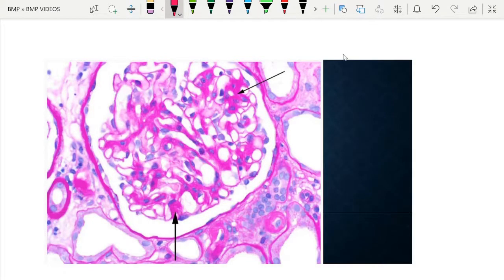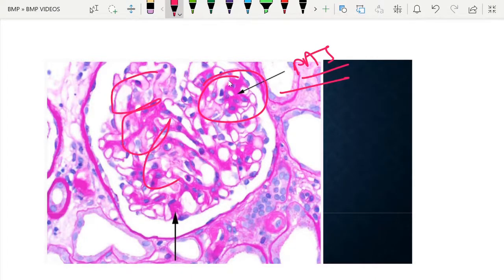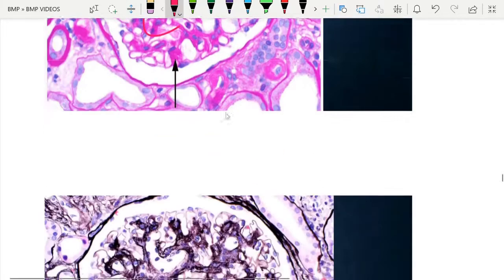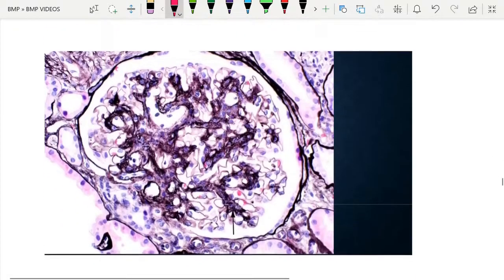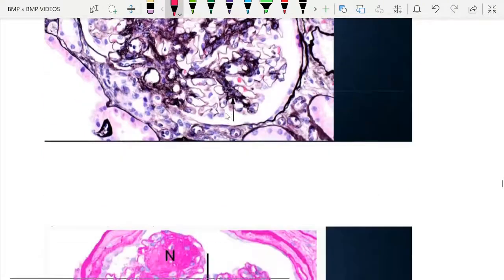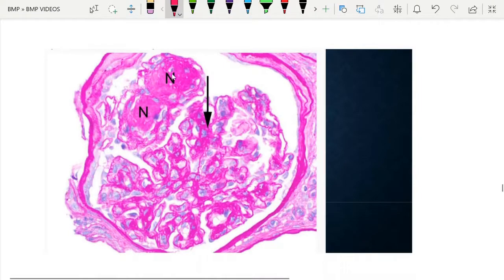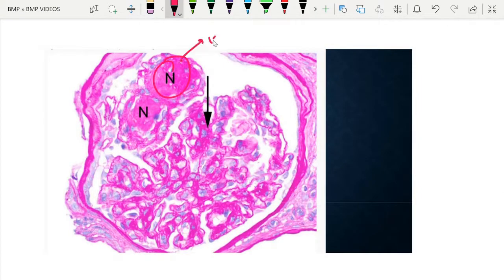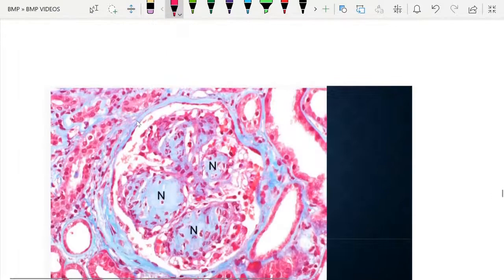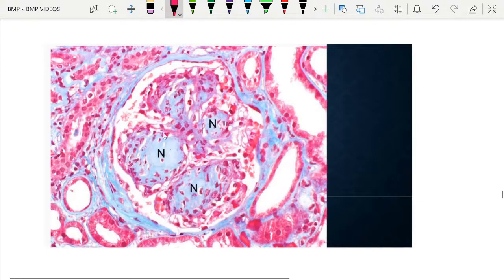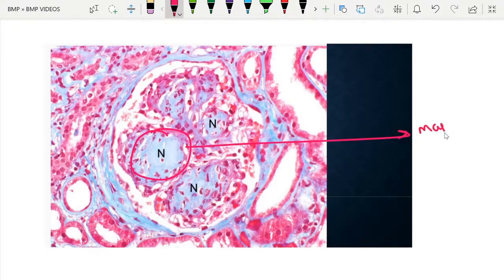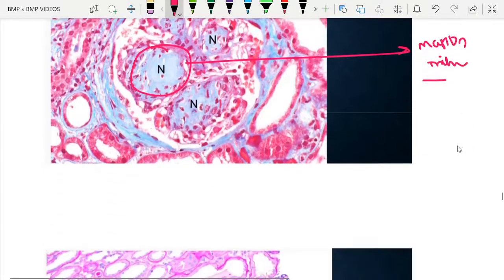Focusing on the Kimmelstiel-Wilson nodules in PAS stain — the mesangial expansion starts in the central part of the peripheral lobule. Jones methenamine silver stain is used for mesangial expansion. The nodules are visible, varying in size from smaller to larger.